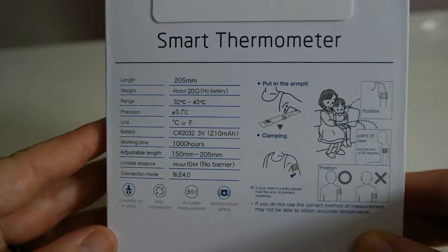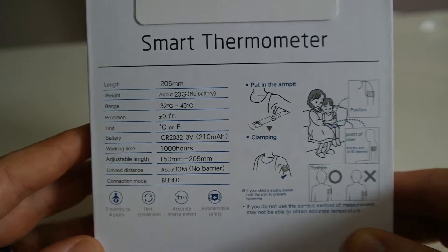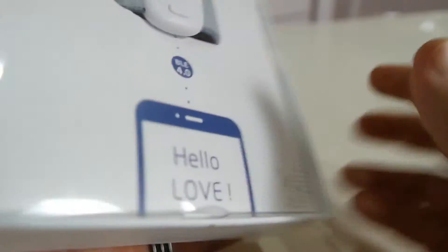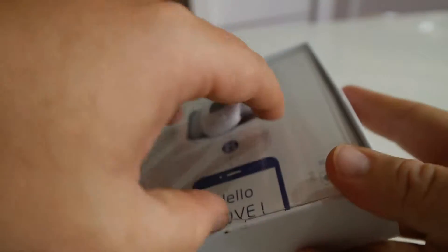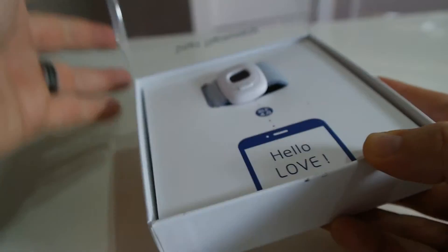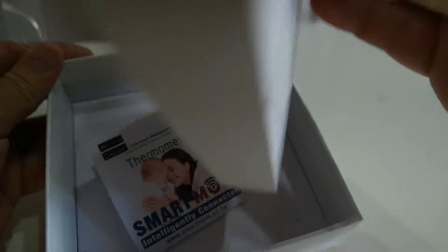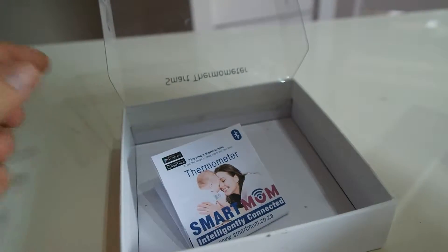So let's quickly have a look at this. On the back there's some nice information and all of the specs of this thermometer — we'll cover that in a different video. This one is just to show you the product itself and how it looks. There's also a little information guide inside.